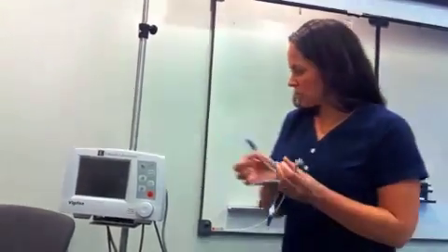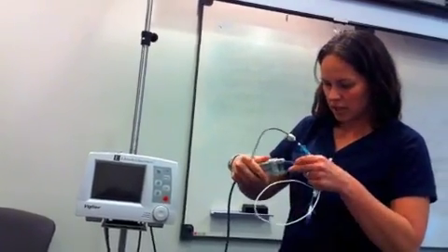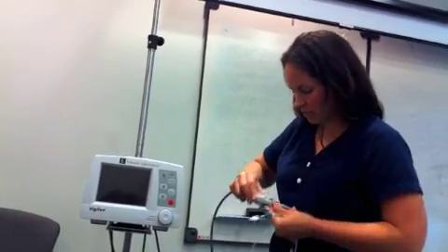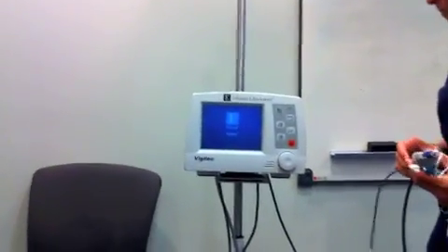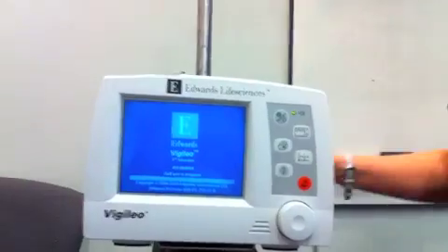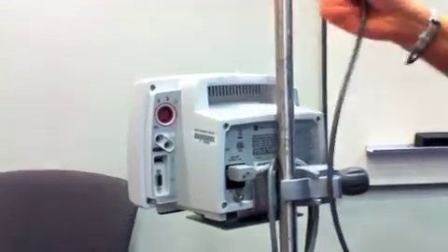Then you'll take this and hook it up into here, and it snaps into place. Turn on your machine. There's a plug in the back that has to be hooked up into the back — it goes right here. So you'll put that into there.